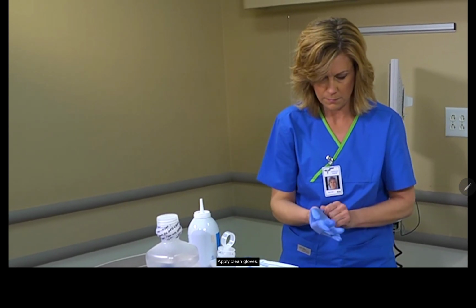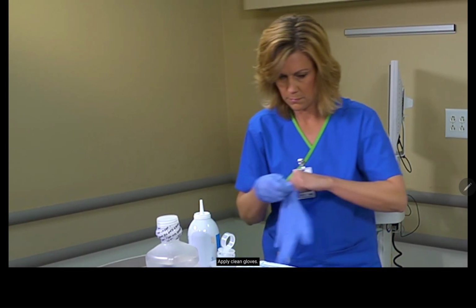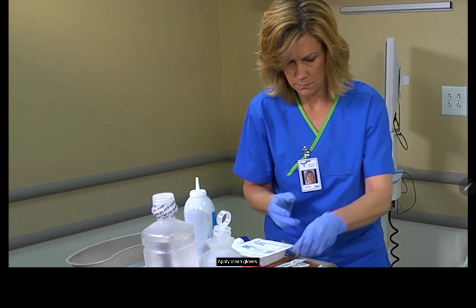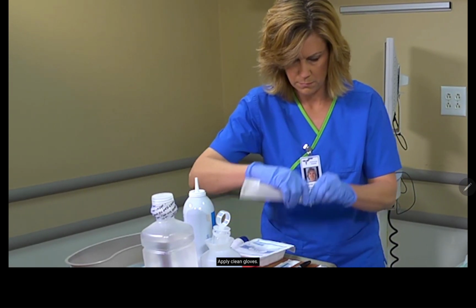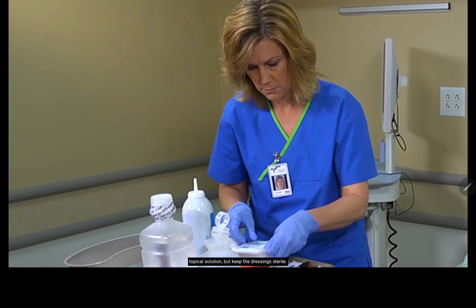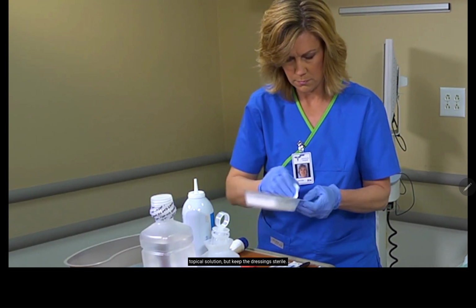Apply clean gloves. Open all the sterile packages and containers of topical solution, but keep the dressings sterile.